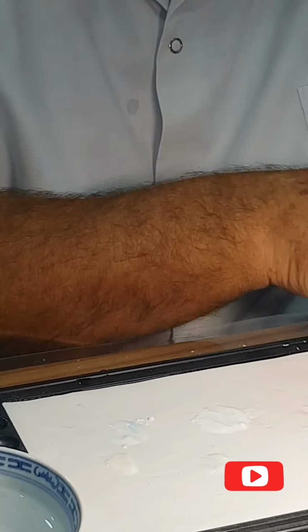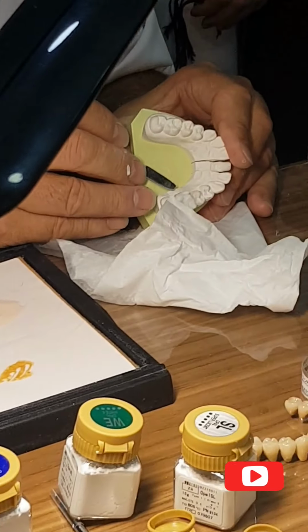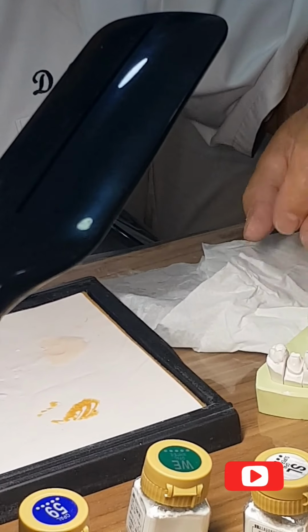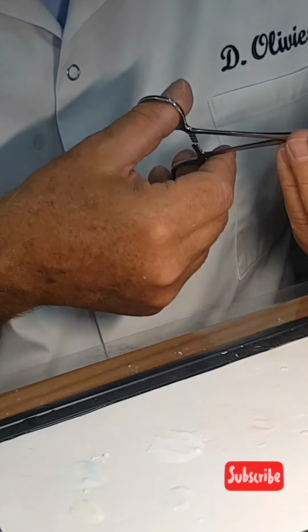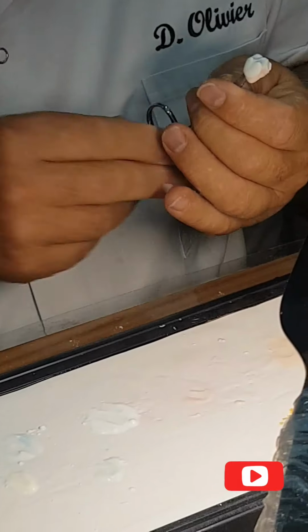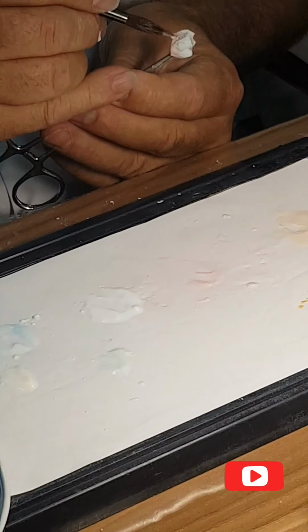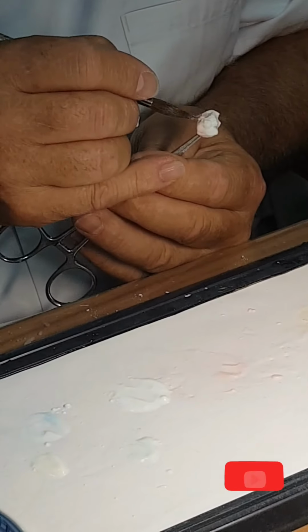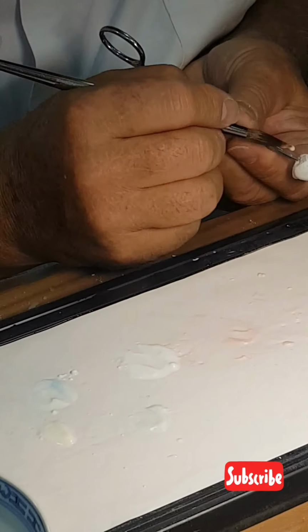I check if I have enough materials. Okay. And now I'm going to remove my porcelain. And I finish it. In that part, it's normal with my root materials. I have to be very logical. Here and here.